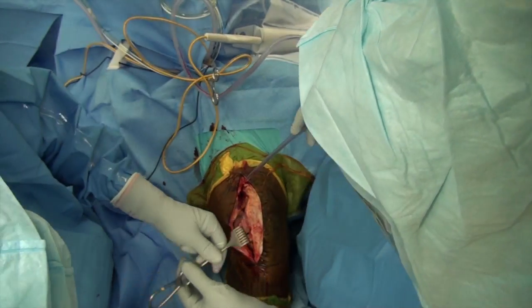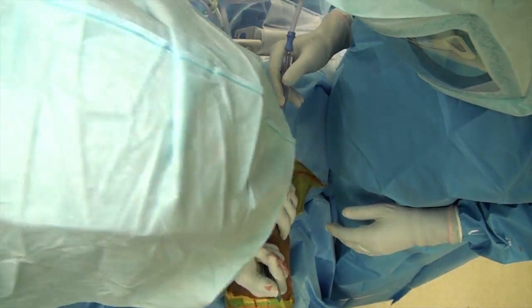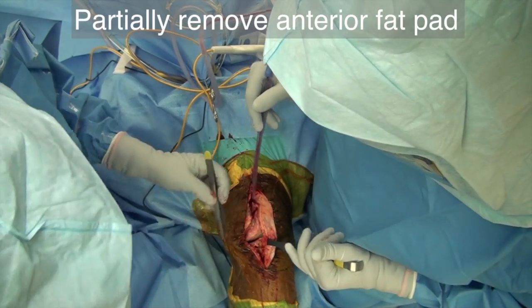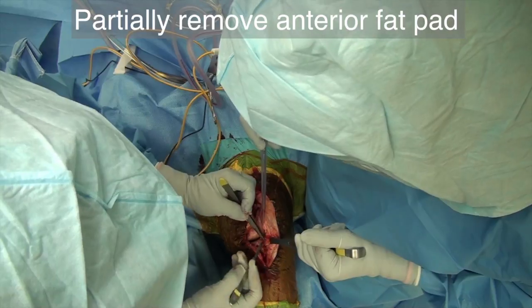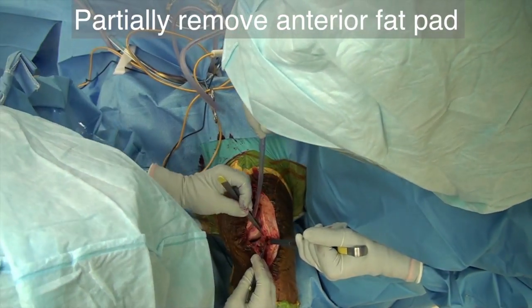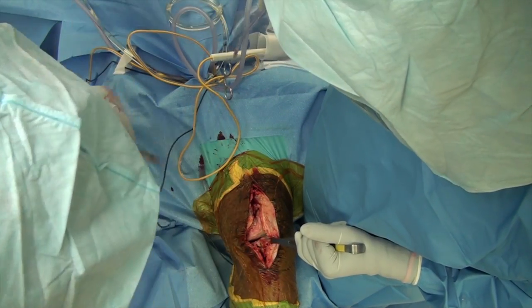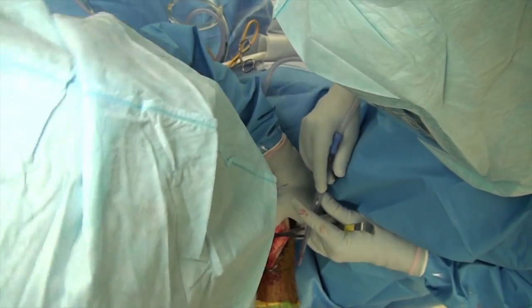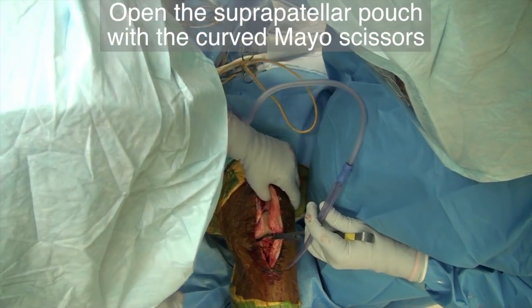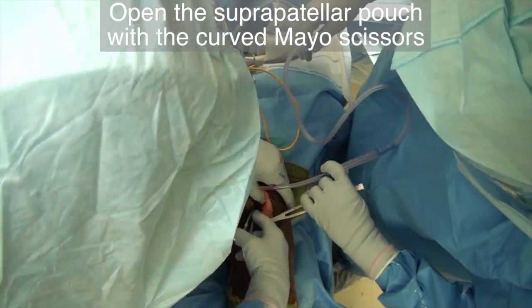Place the army-navy retractor right below the patellar tendon. You may need to use a knife to perform a puncture if the retractor doesn't go in easily. Then partially remove the fat pad from the anterior aspect of the knee joint. Open the suprapatellar pouch with curved Mayo scissors.